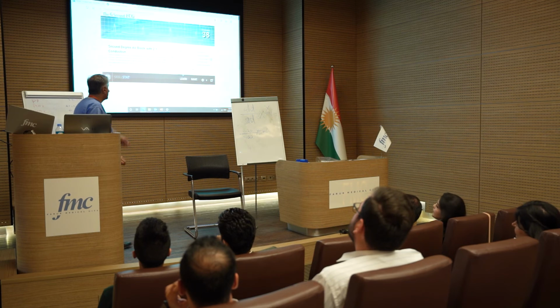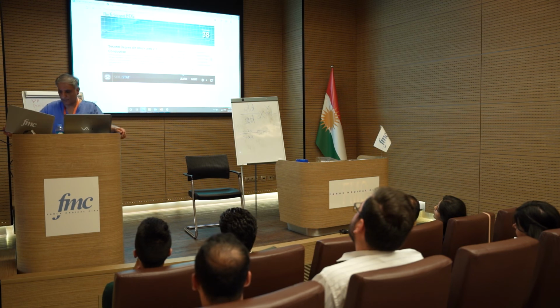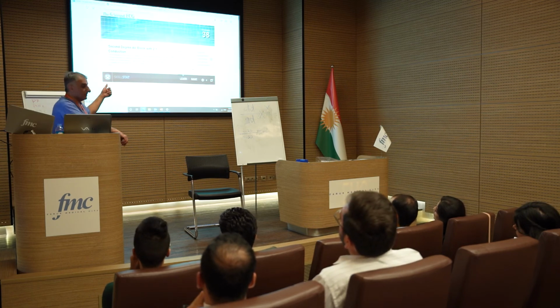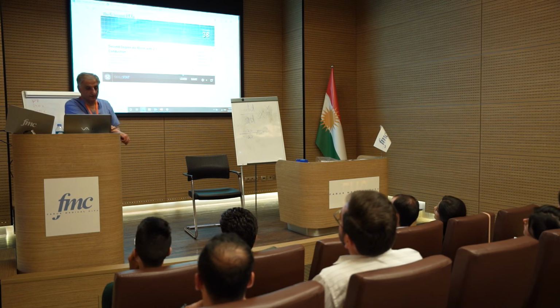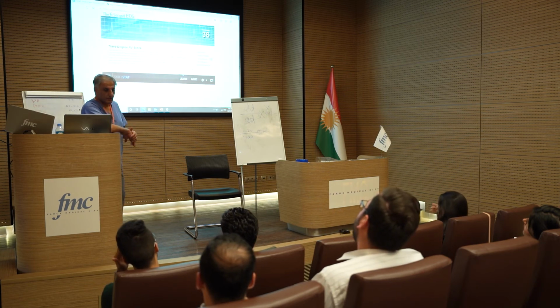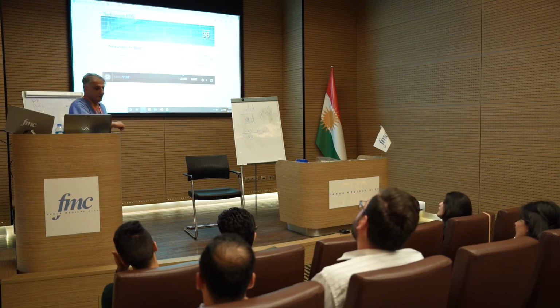In the other one there is a pattern: 2, 1, 2, 1, 2, 1. That's second degree heart block, 2 to 1 block. That's going to be regular, while the other one is irregular. And in this one there is a complete dissociation between the ventricular and the atrial activity. That's the third degree you have here.